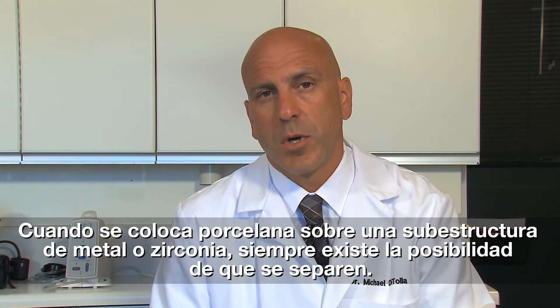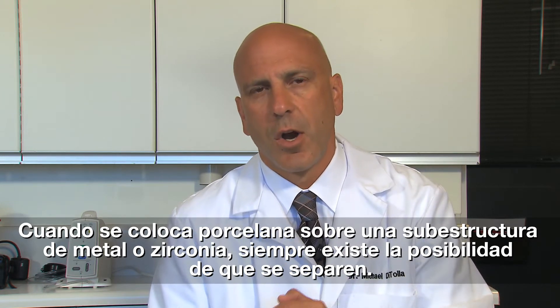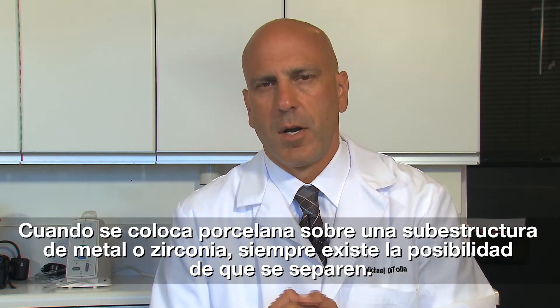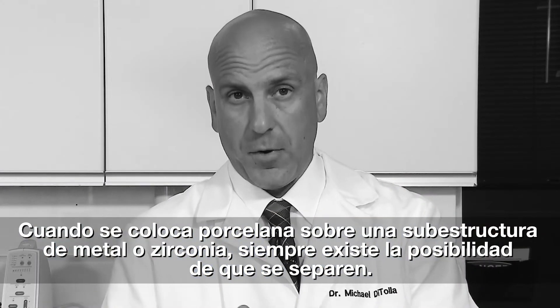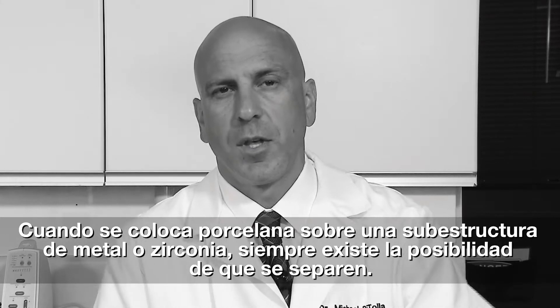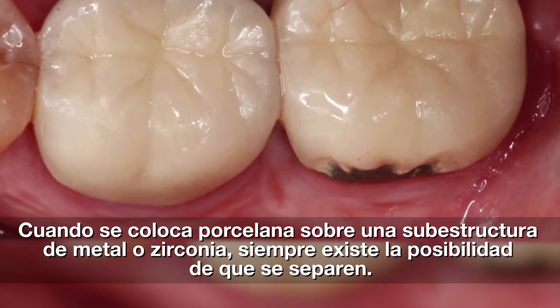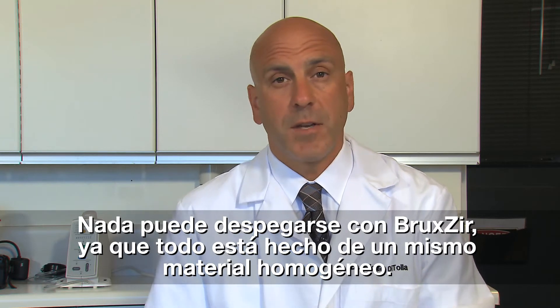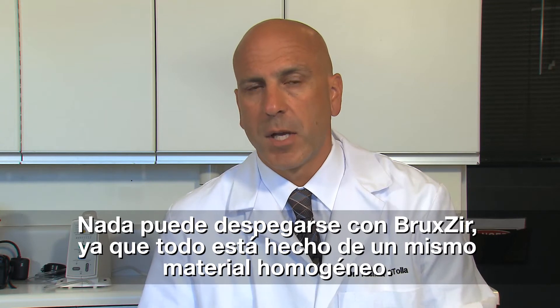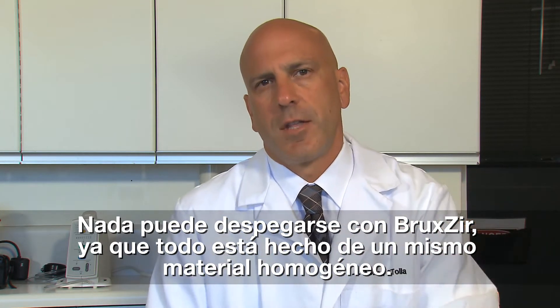One of the big reasons is when you take porcelain and you put it on something — whether it be a metal substructure or a zirconia substructure — when you put those two layers together, there's always the possibility that those two layers are going to come apart. The best case scenario is just some chipping on the porcelain that you might be able to polish, unless it's an anterior tooth, or the porcelain can break off all the way, exposing the zirconia or metal substructure. So one of the big benefits of having a monolithic restoration is that nothing can chip off of it, because it's all made out of one homogeneous material.